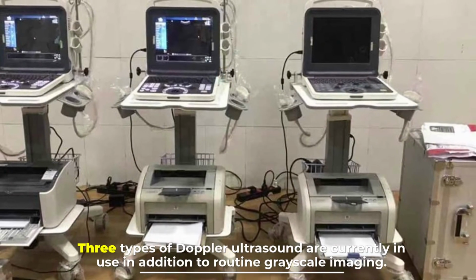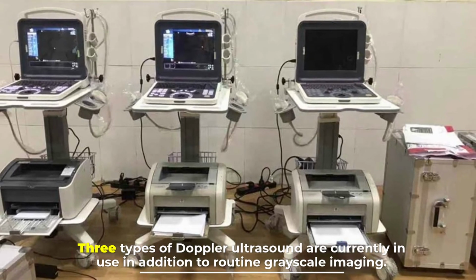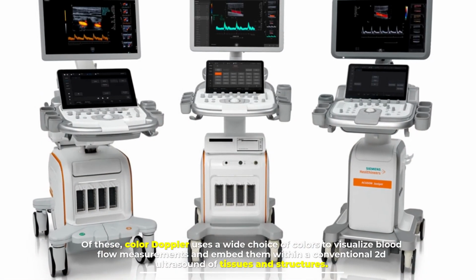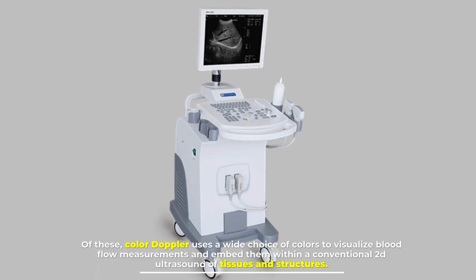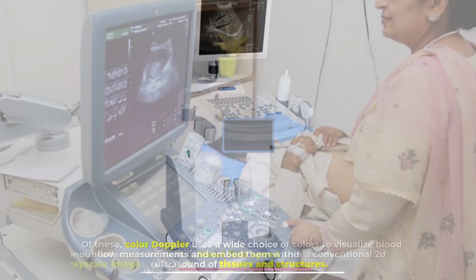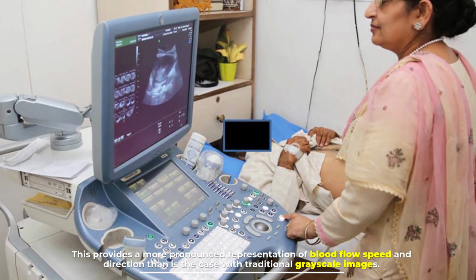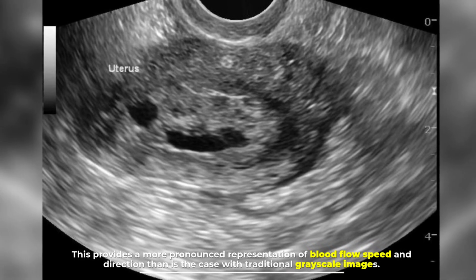Three types of Doppler ultrasound are currently in use in addition to routine grayscale imaging. Of these, color Doppler uses a wide choice of colors to visualize blood flow measurements and embed them within a conventional 2D ultrasound of tissues and structures. This provides a more pronounced representation of blood flow speed and direction than is the case with traditional grayscale images.